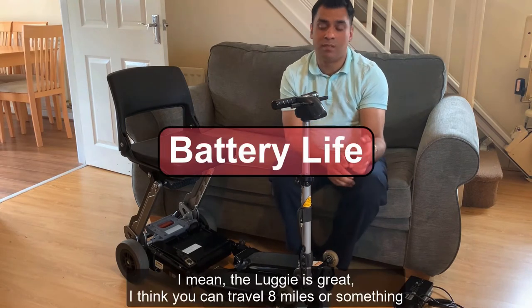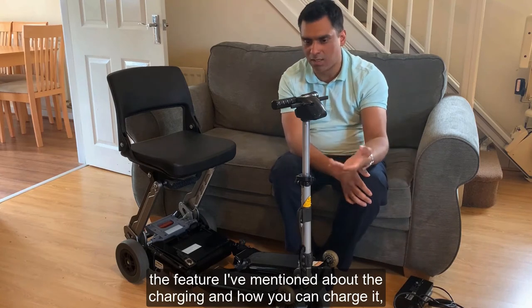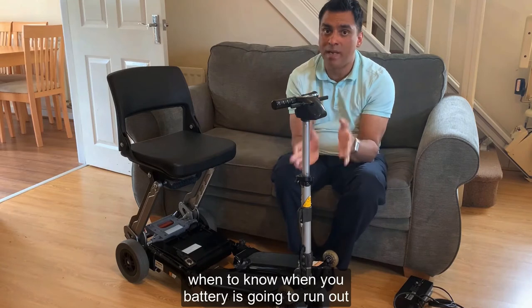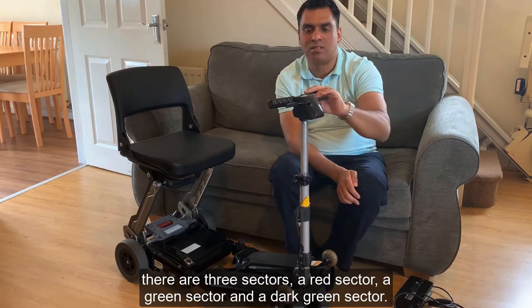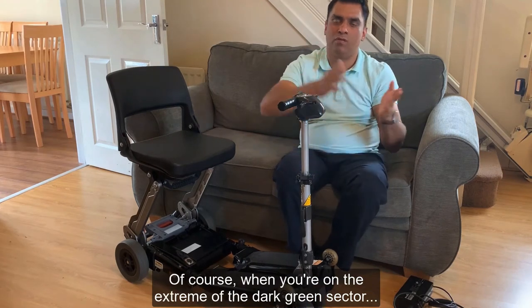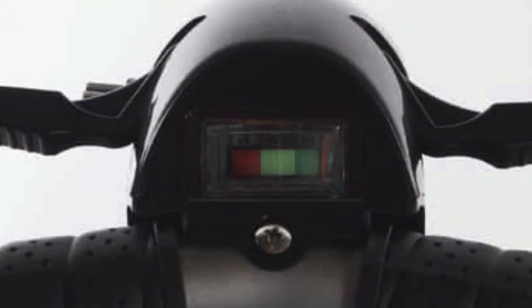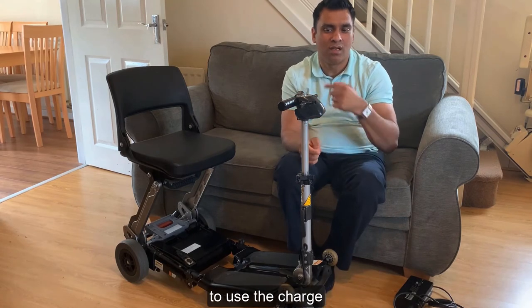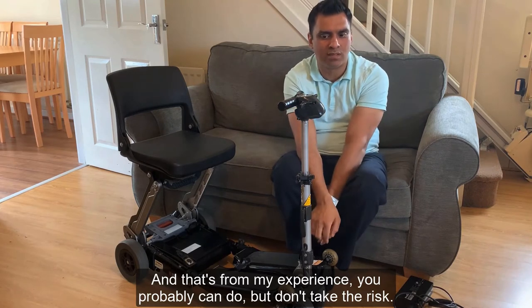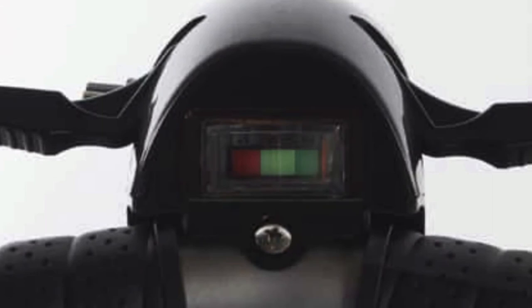Battery management is important. The Luggy can travel about eight miles on a smooth surface, but you need to know when charge is getting low. The gauge has three sections: a dark green, a normal green, and a red. Don't treat the needle in the middle as half charge - when it's in the middle that's closer to a quarter charge. As soon as it gets into the red area you're pretty much out. Don't rely on the whole red area - when it hits red, start heading back.